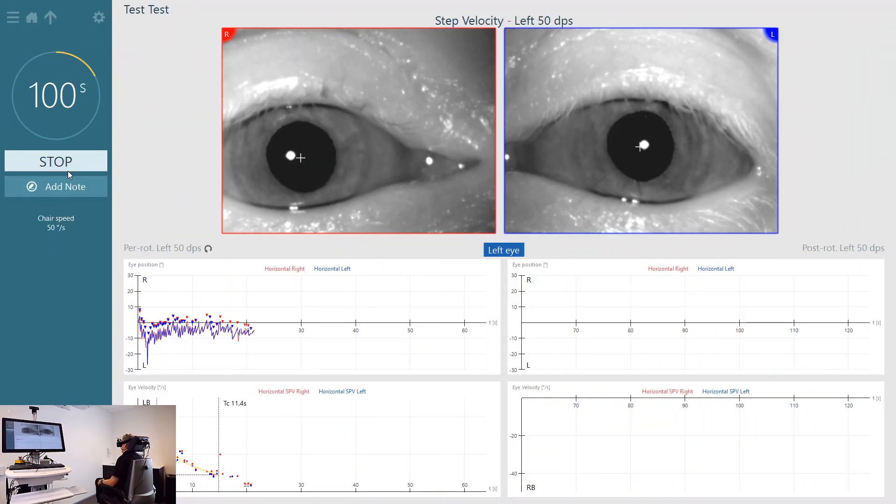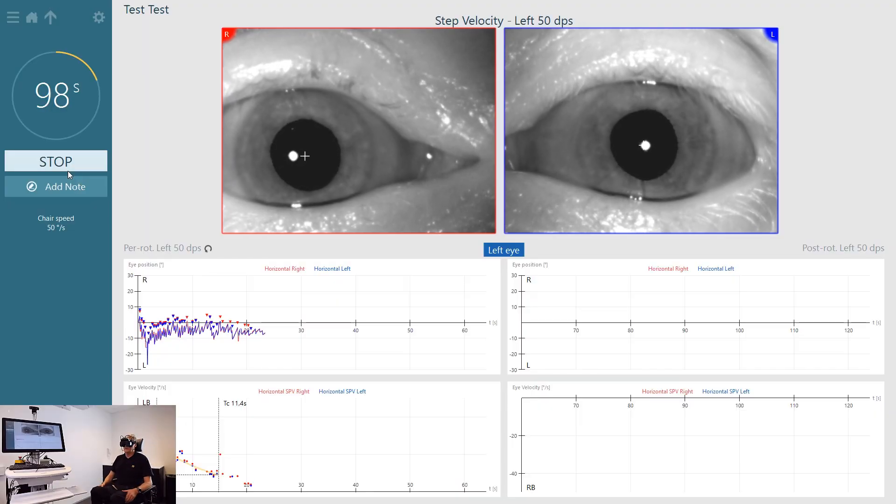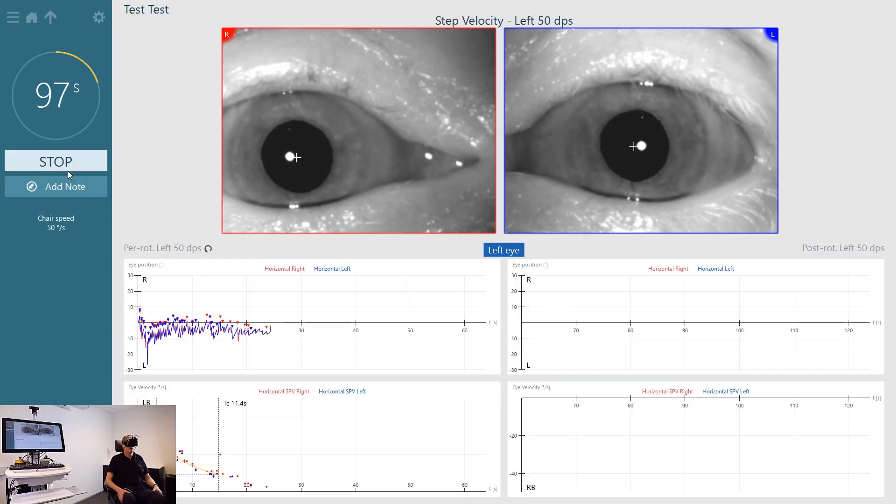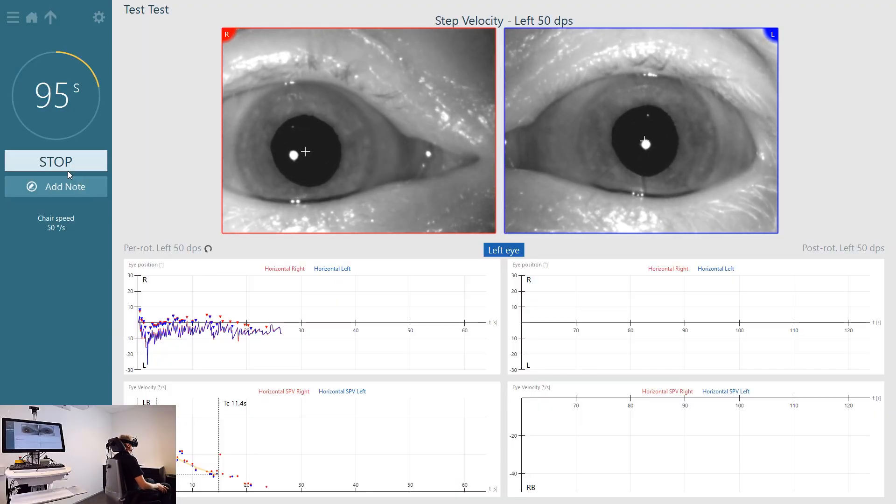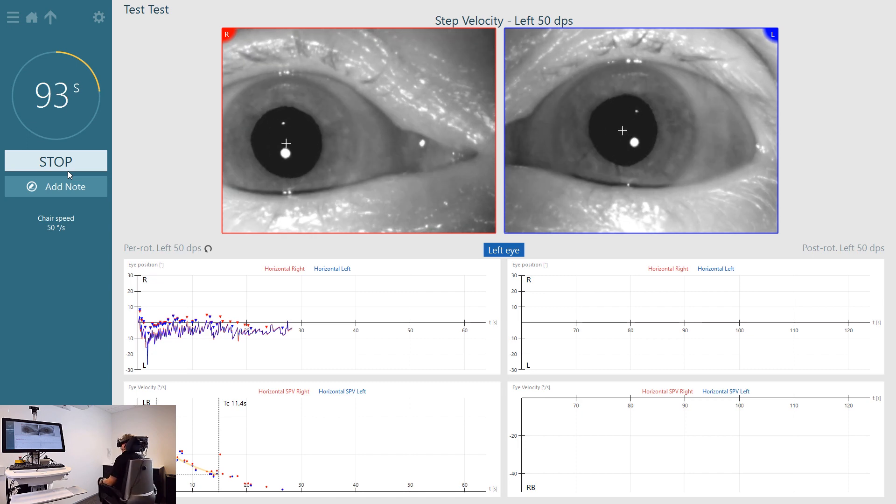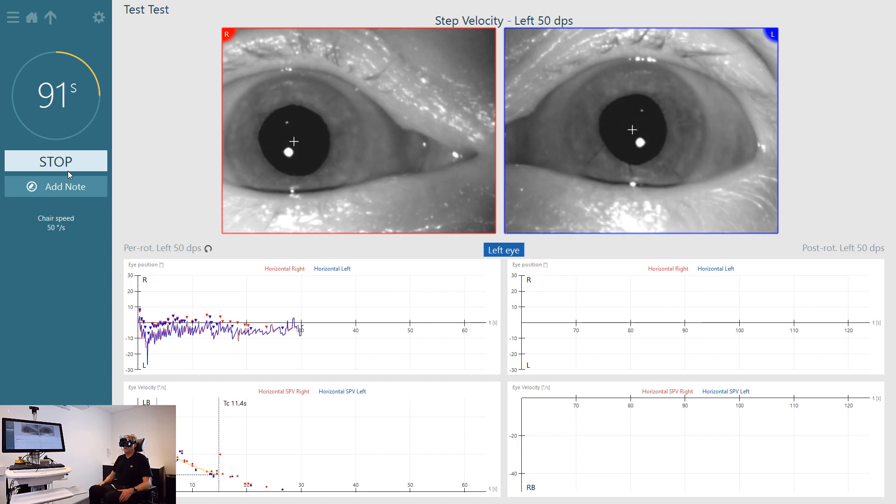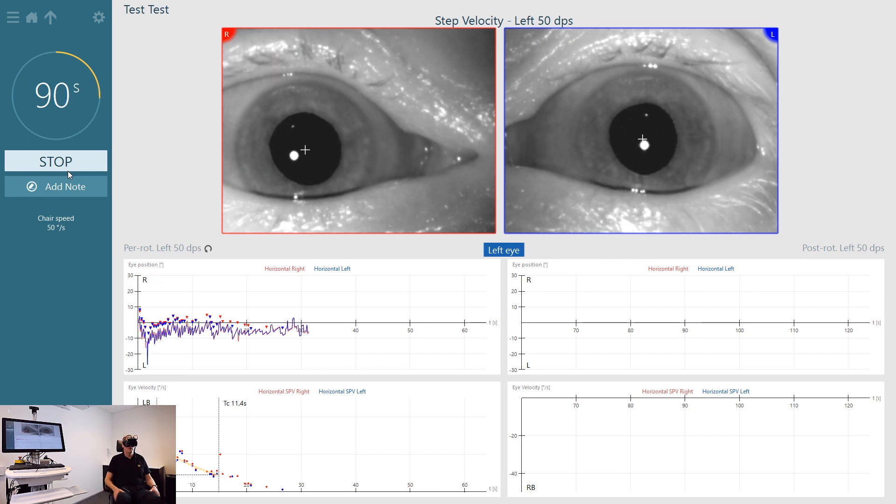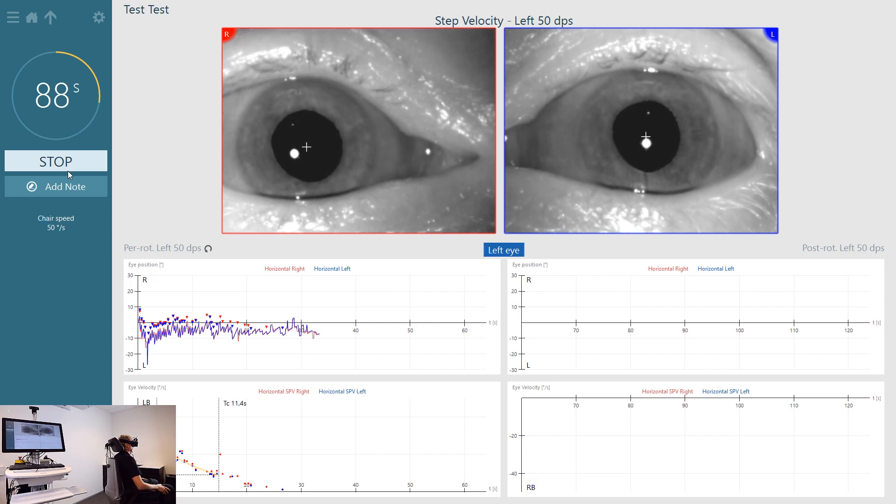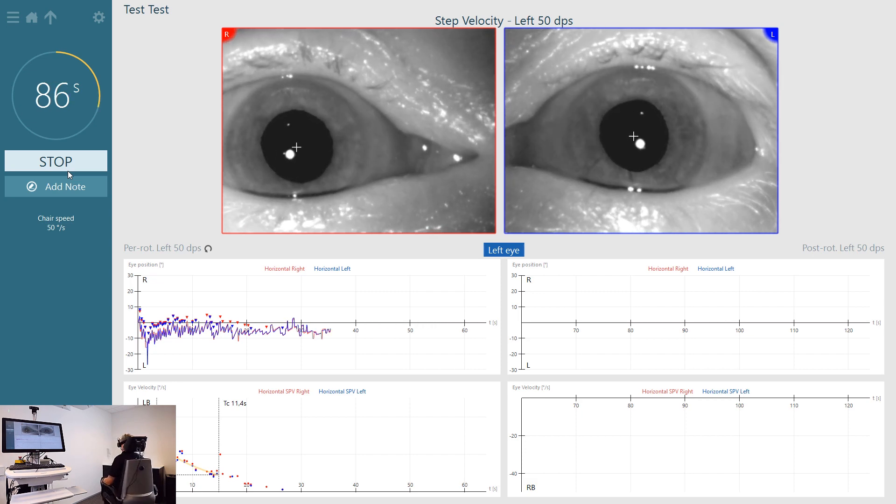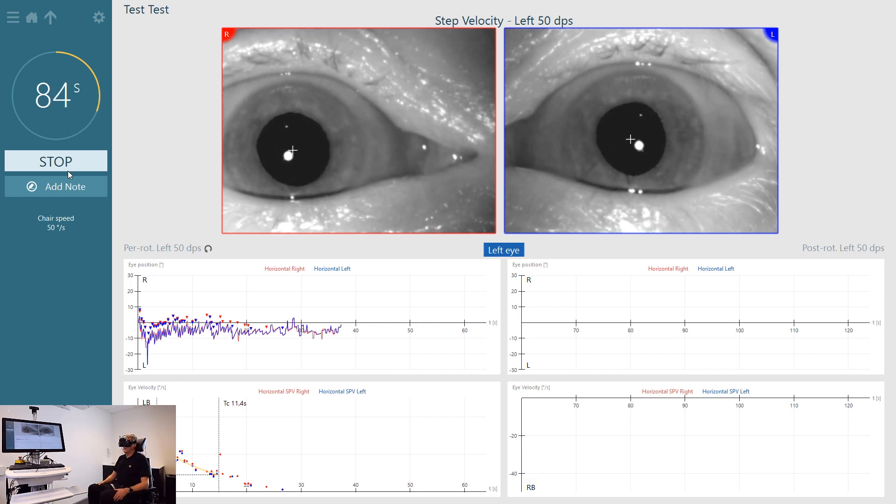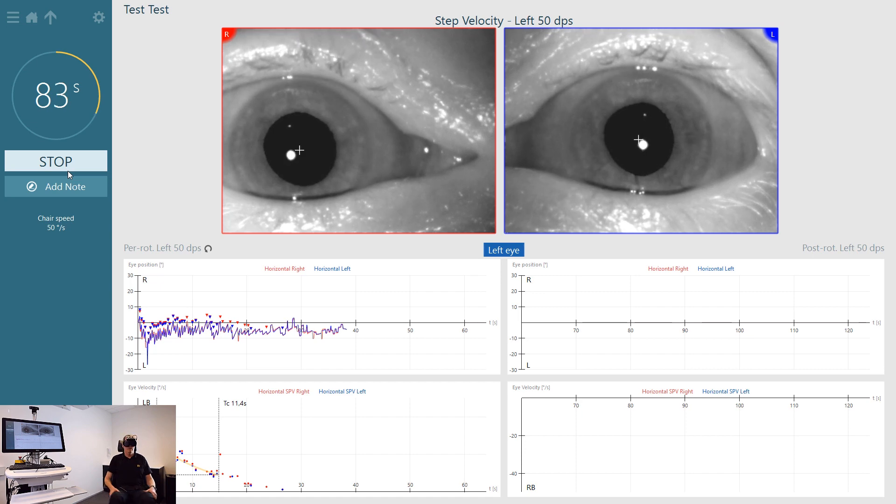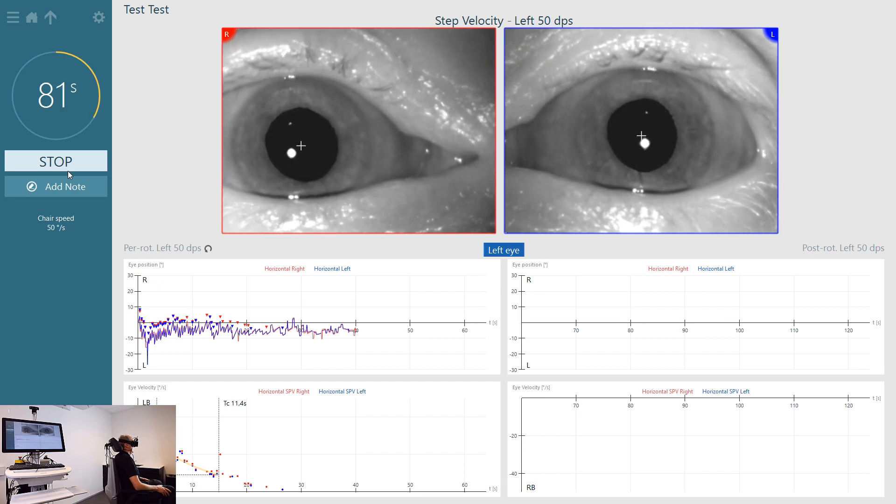The patient is accelerated up to a fixed velocity where they will be spun for 60 seconds. Then at the same rate they will decelerate back to still and again will be recorded for 60 seconds. This will happen in one direction and then the other direction.